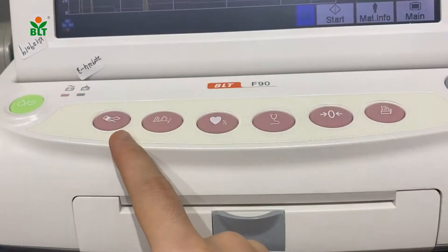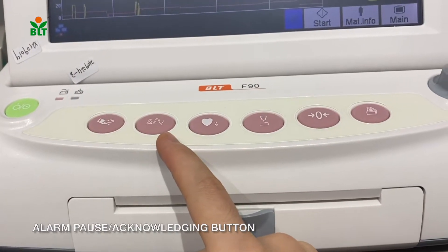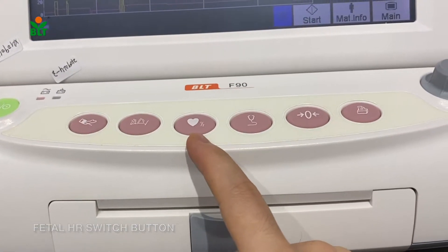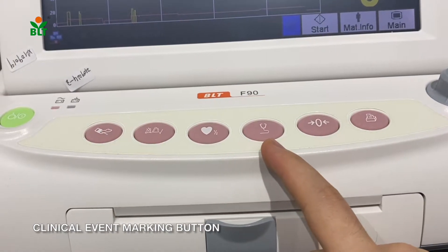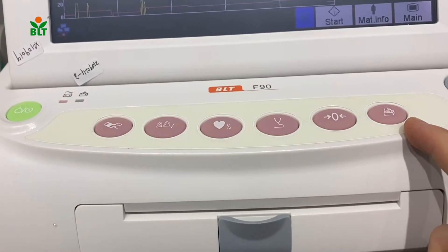We have the NIBP measurement button, alarm pause acknowledgement button, fetal heart rate 1 and fetal heart rate 2 switch button, clinical event marking button, toco reset button, and the print button.